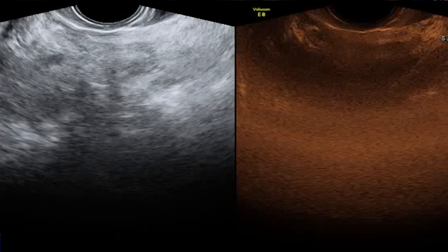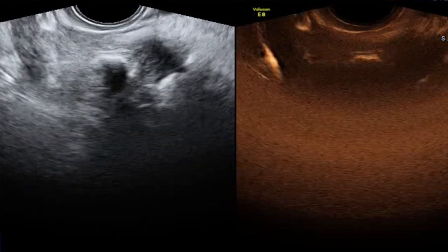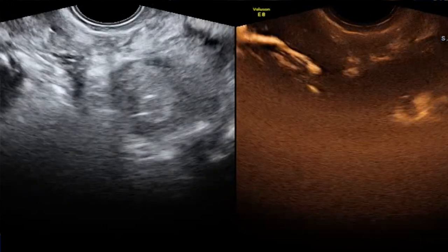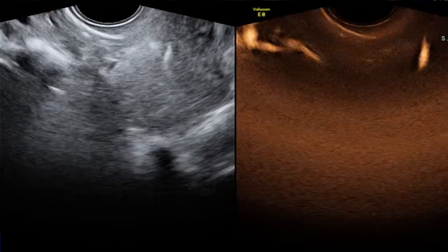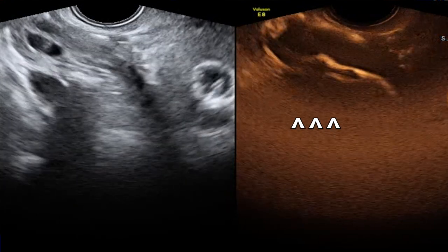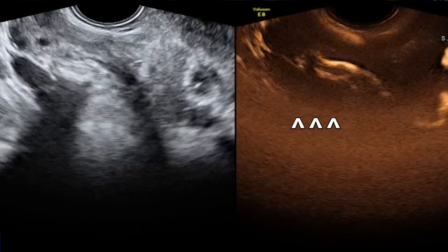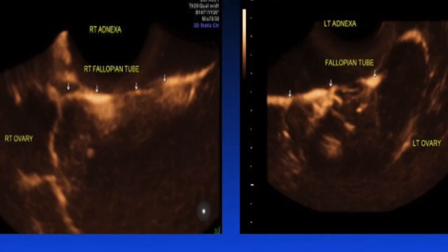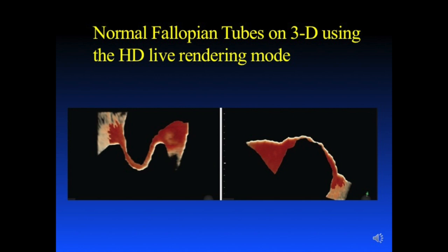This is the right fallopian tube showing the smooth walls and the fimbrial end and the right periovarian diffusion. This is a 3D reconstruction of the right fallopian tube and periovarian diffusion, and the left fallopian tube with the left periovarian diffusion.